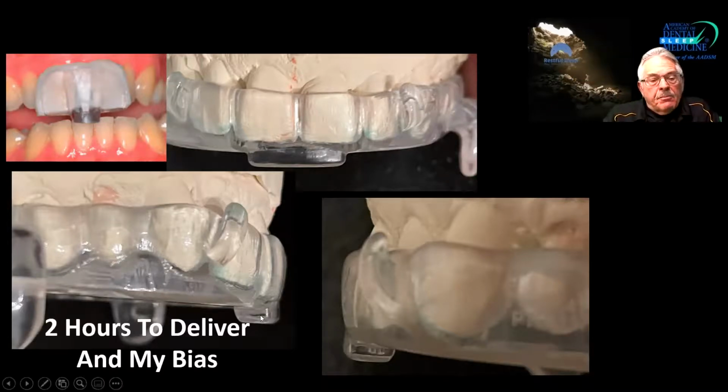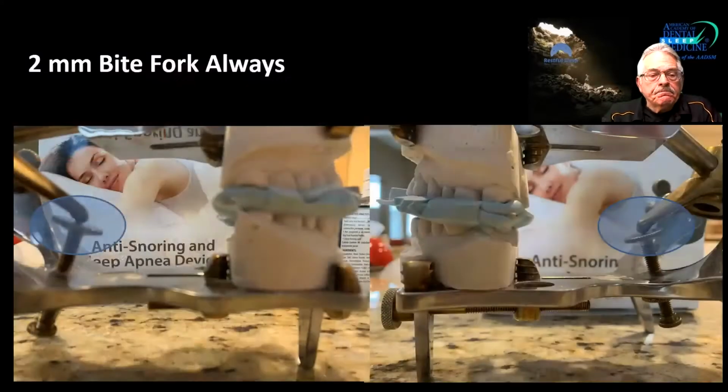So you can either make the bump longer this way, anteriorly. You don't have to worry about lingual because the appliance is going to prevent it from going back. Or you can make the platform, if you can call it that, on the lower longer. I don't really know about this appliance, but in that particular scheme of things, if you're going to put anterior midpoint stops on appliances, you've got to kind of look at that too.